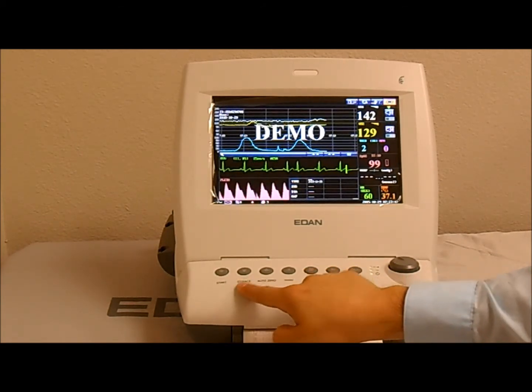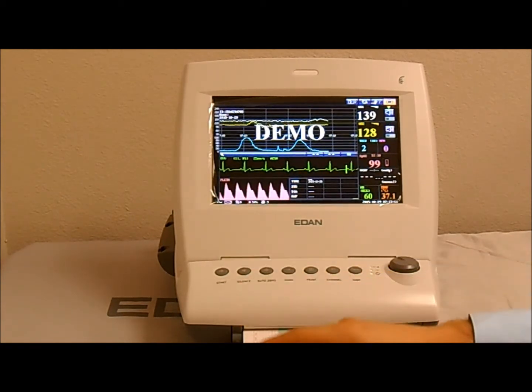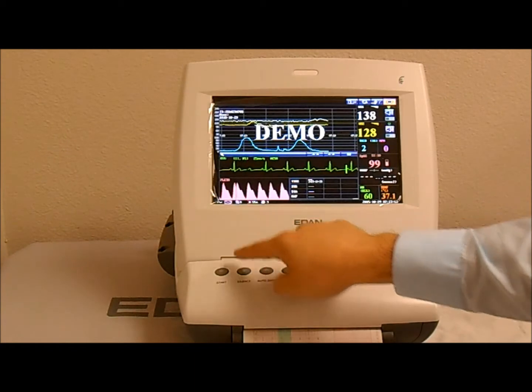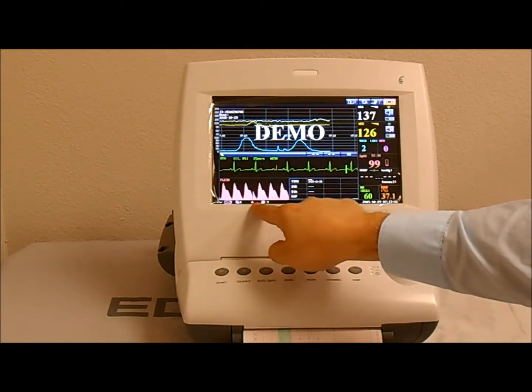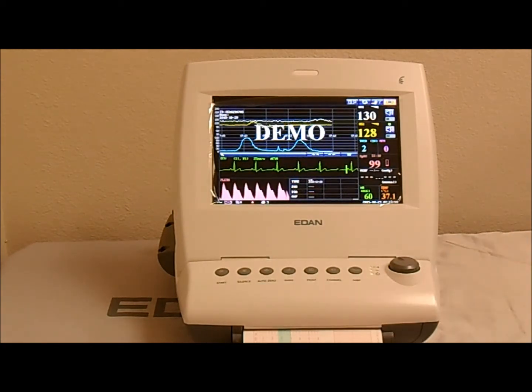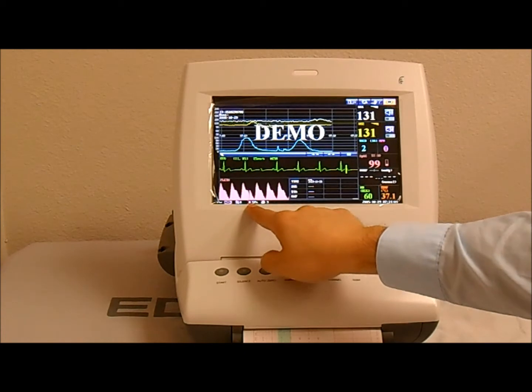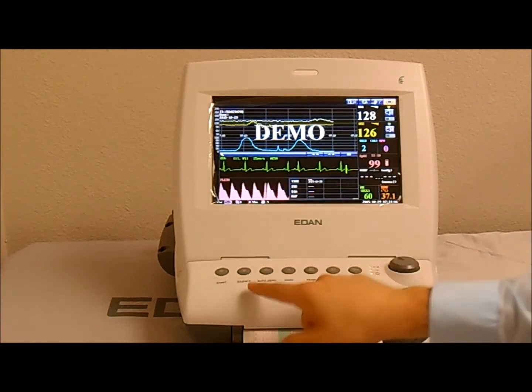The next key is the silence key. Press it to mute any alarms that are going off. If you take a look, on the bottom of the screen there's a little bell. If it's not crossed over, it means that there's no mute period going on. If you press it, there's going to be an X over the bell, which means that the alarm is muted.